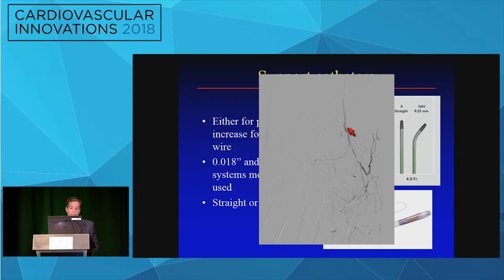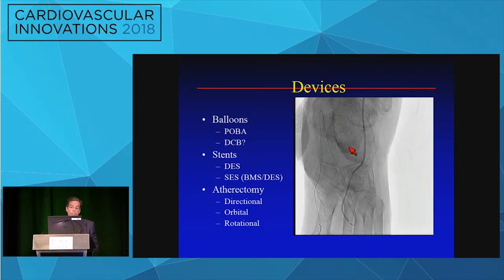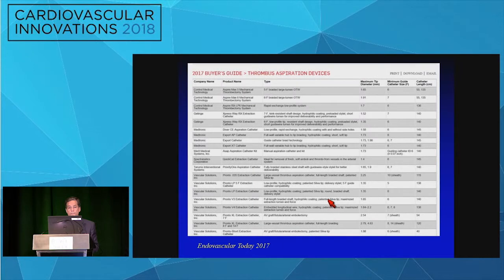a termination of a peroneal artery trying to revascularize a limb, and come around and actually use that as a conduit for retrograde pedal, meaning through the transcollateral, and then work antegrade to work around the pedal arch. And you've already seen this picture with the revascularization of the tibials.